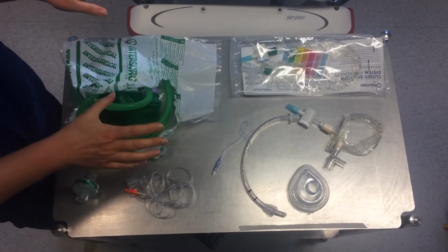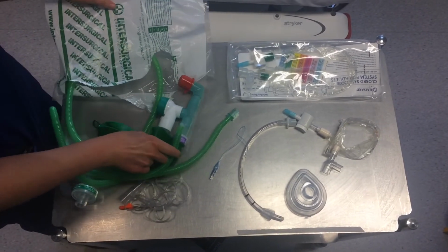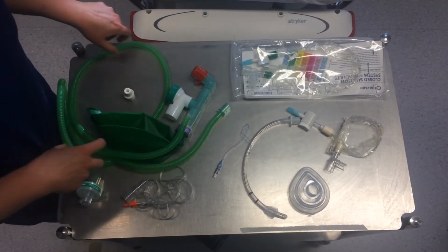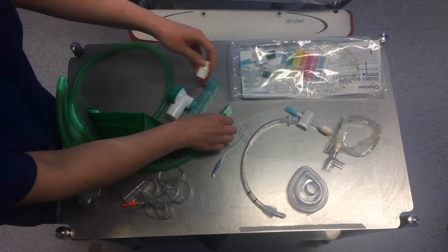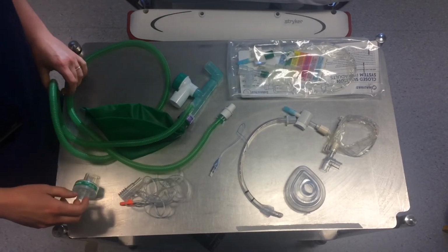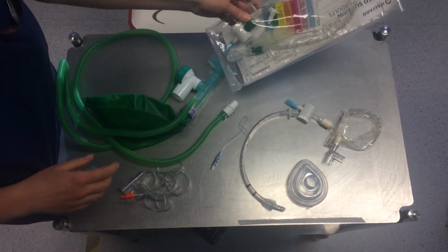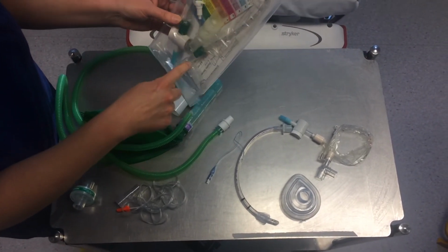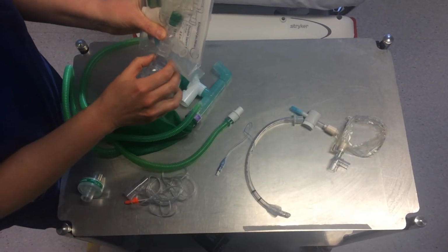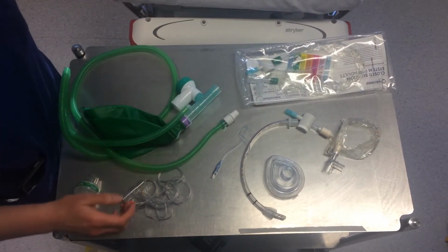So for bigger children who are using a water circuit, it's also in one of these bags, and this comes in a separate bag. You'll need to attach that to the end and take the cap off. We still need the same parts of the circuit, but for bigger children, the closed suction might have this double rim, so it will fit directly onto the mask, which means as you connect your circuit up, you don't need the double angle piece, so you could remove that.